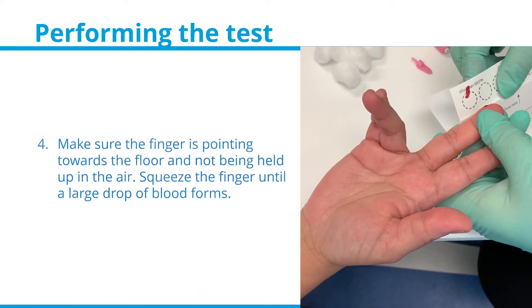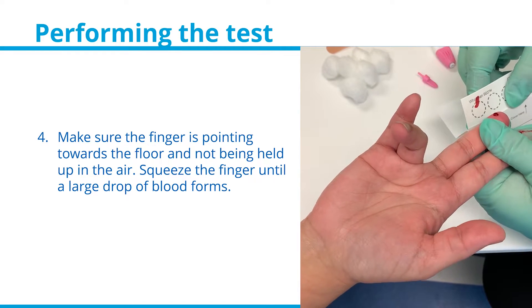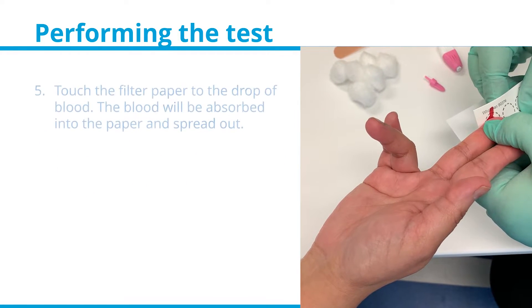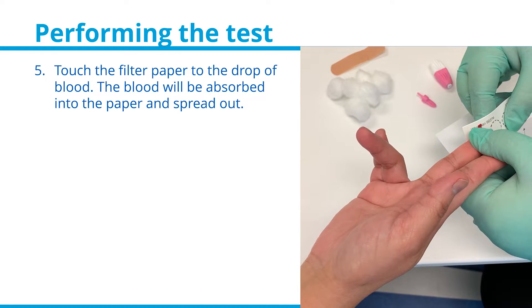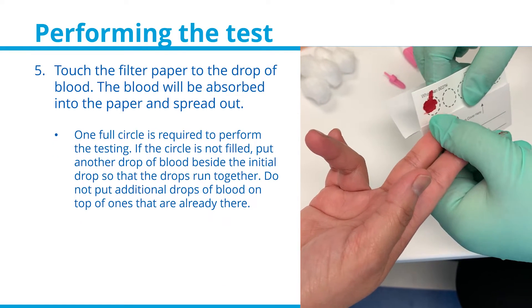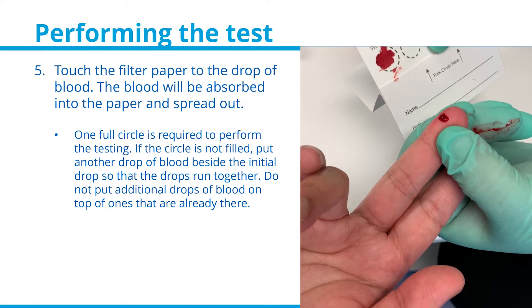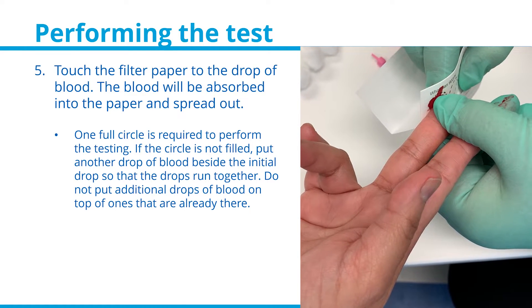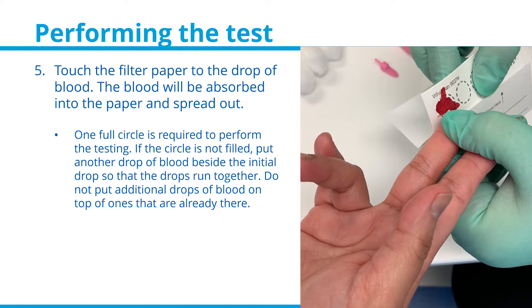Make sure the finger is pointing towards the floor and not being held up in the air. Squeeze the finger until a large drop of blood forms. Touch the filter paper to the drop of blood; the blood will be absorbed into the paper and spread out. Only one full circle is required to perform the testing. If the circle is not filled, put another drop of blood beside the initial drop so that the drops run together.